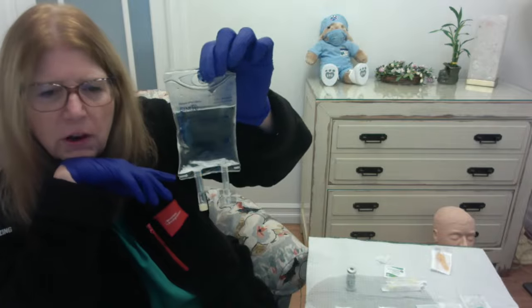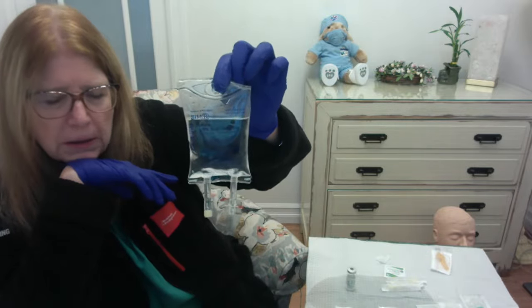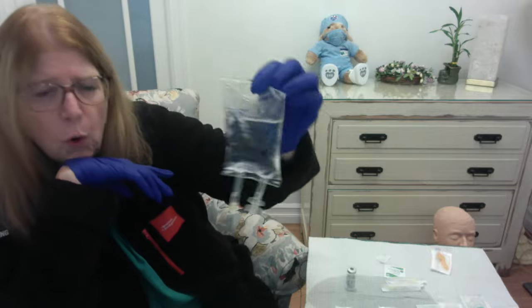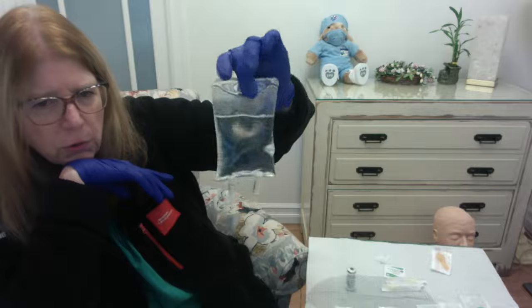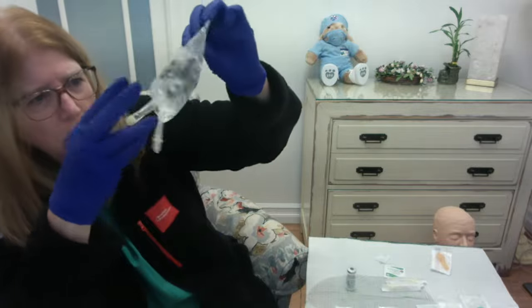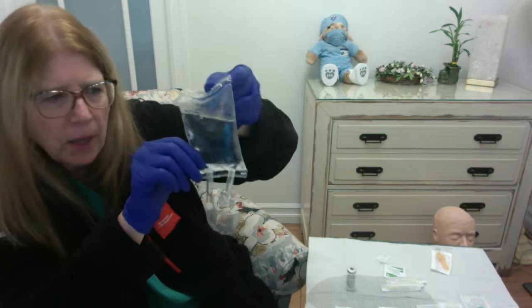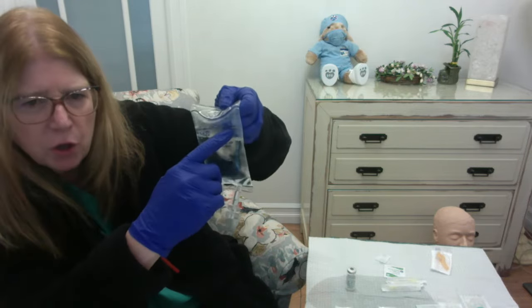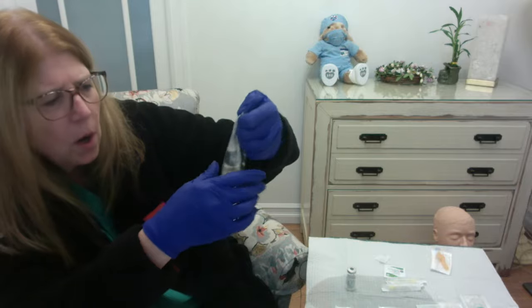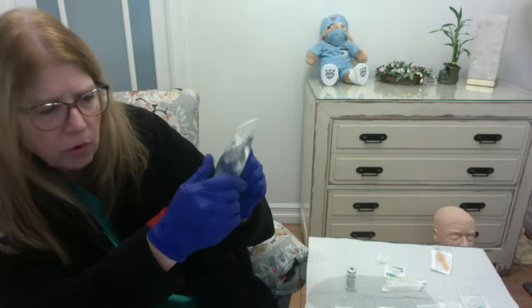So IV bags come in different sizes. This is a small 100 milliliter bag, and this is normal saline, 0.9%. Whenever you're going to use an IV bag, you want to hold it up to the light. You want to have a look, make sure that there's nothing floating in it. You want to check the expiration date. This is expiring in January 2024. You want to make sure that your bag is intact, that there are no leaks, okay?